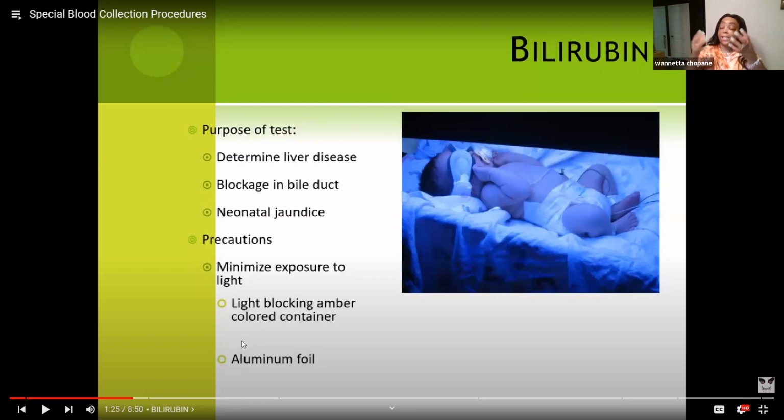That is a tint for the bag. So when the specimen is being transported, that tint protects it from sunlight and any regular light. Because if it is caught by the light, you can only imagine the specimen can be damaged.